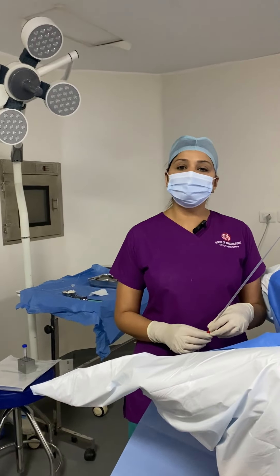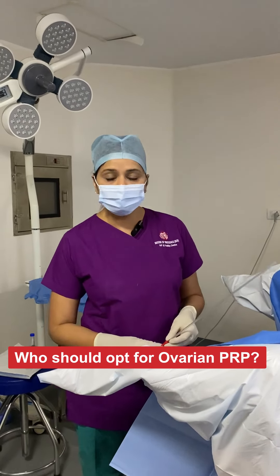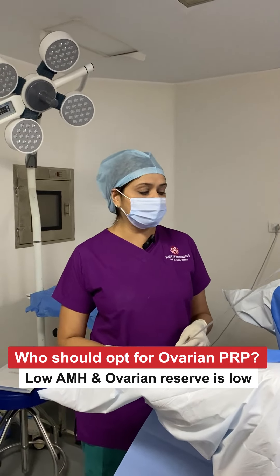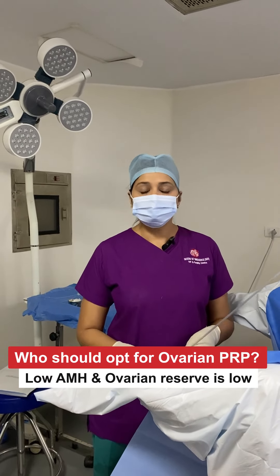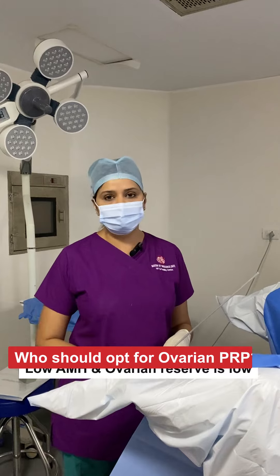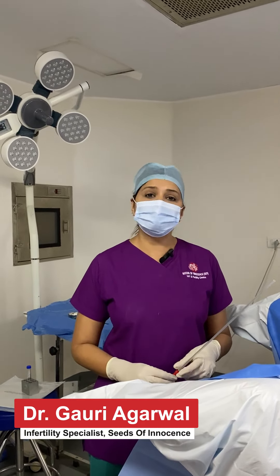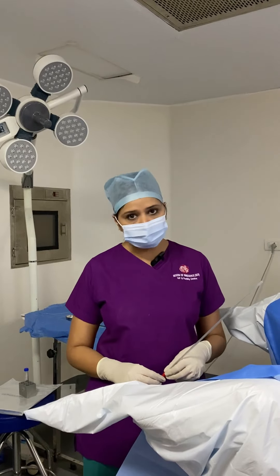Today we're going to show you a procedure of ovarian PRP. Ovarian PRP is done for patients who have low AMH or low ovarian reserve. For patients who are not willing to go ahead with a donor egg, this is a good procedure which is done on day 7 and day 14 of the patient's cycle.